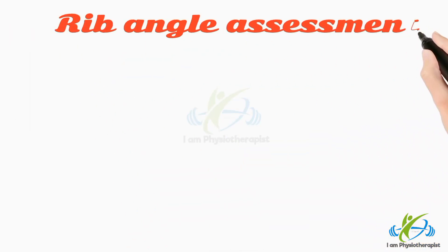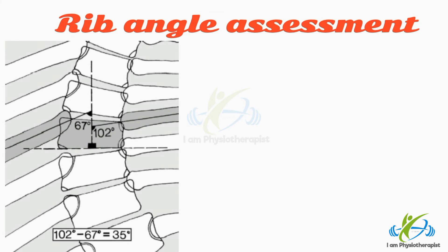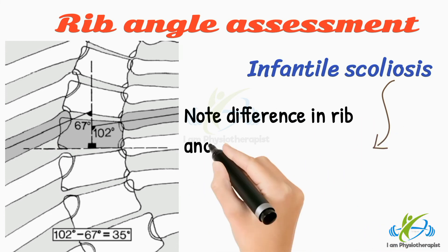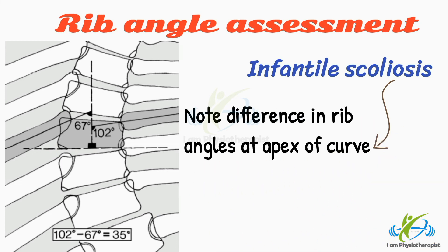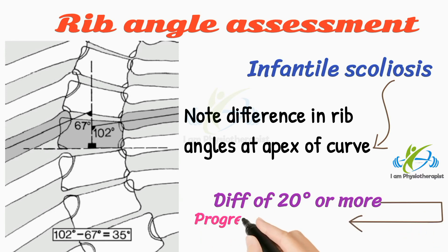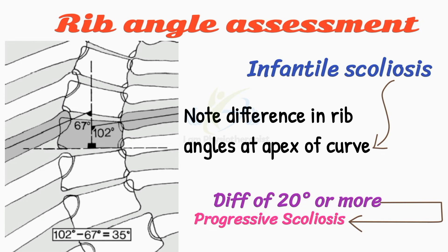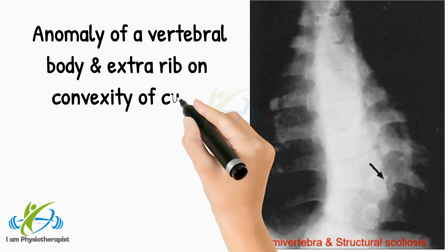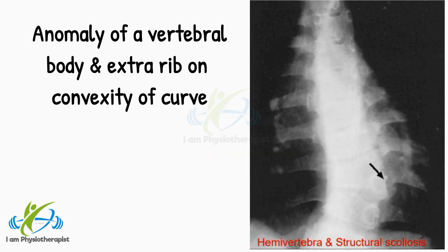Rib angle assessment: In infantile scoliosis, note the difference in rib angles at the apex of the curve by the shown construction. A difference of 20 degrees or more must be regarded as indicating a potentially progressive scoliosis. This radiograph shows a dorsal scoliosis associated with an anomaly of a vertebral body and an extra rib on the convexity of the curve.